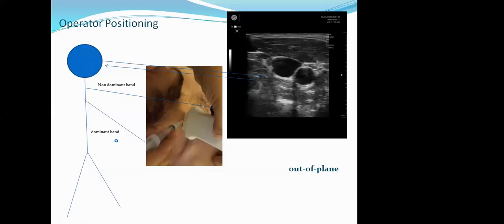Now in this cartoon, I showed you the position of the operator. So the patient is lying over here, and the operator usually stands along the head of the patient side, and you see the non-dominant hand is holding the probe, and the dominant hand is holding the syringe with which you puncture the vein.